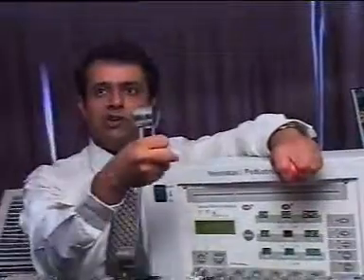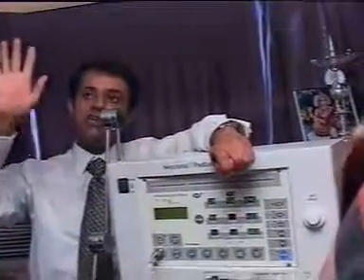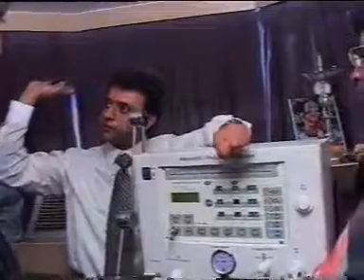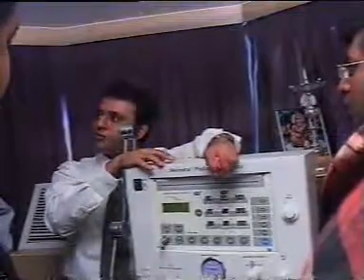Driving pressure, tidal volume. Tidal volume अंदर गया तो क्या होगा effectively? Oxygen बढ़ेगा और carbon dioxide कम होगा. So PIP increases PaO2 of the baby or oxygen of the baby and causes effective removal of carbon dioxide. Clear? What does the PEEP do to the PaO2 and the oxygen and carbon dioxide?